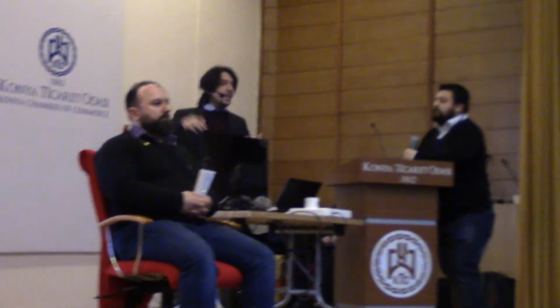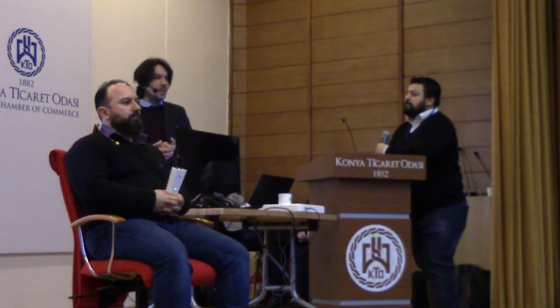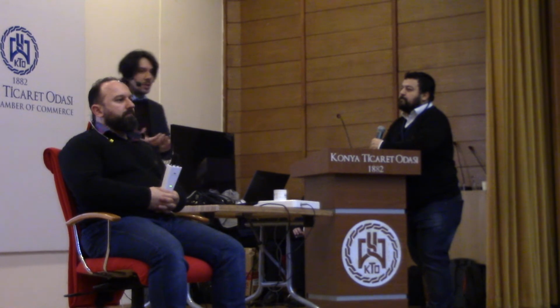But there's another way to use VEMPs: in the frequency domain. It means I send stimuli at different frequencies and I check what happens.